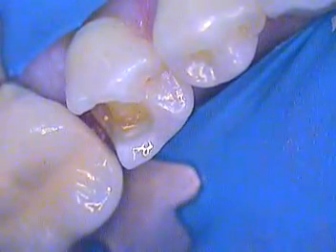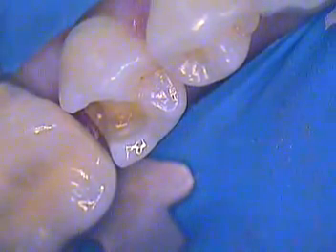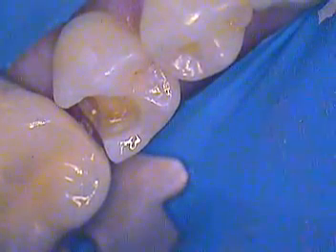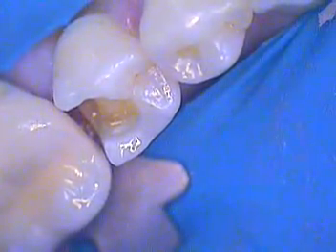Hello and welcome back. This is Dr. Jerry Cuomo. I'm here with my patient and we're working on teeth numbers 20 and 21. We just finished the tooth preparation, decay removal, and we sealed our tooth now with the Denton bonding agent.